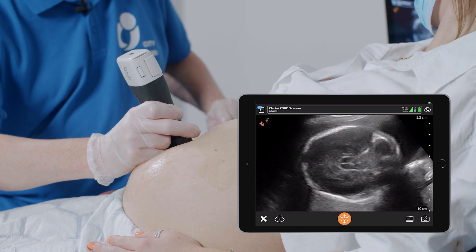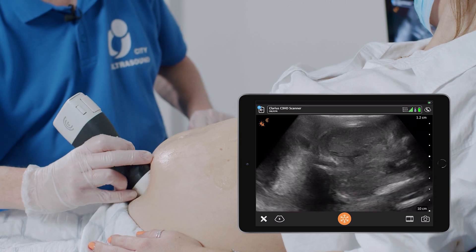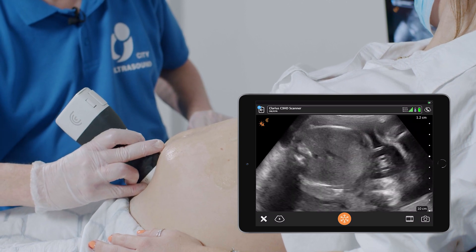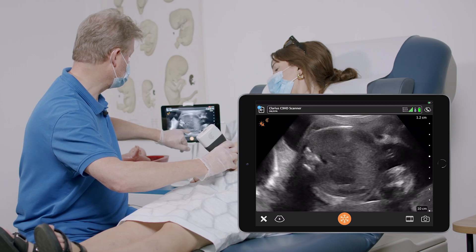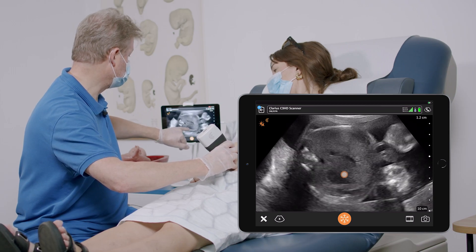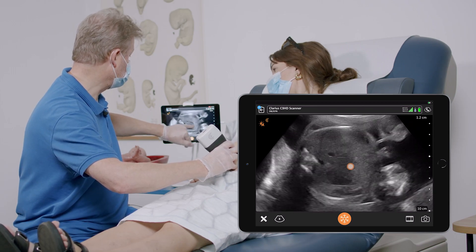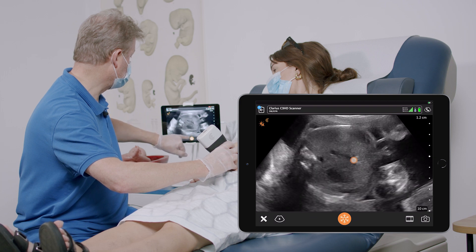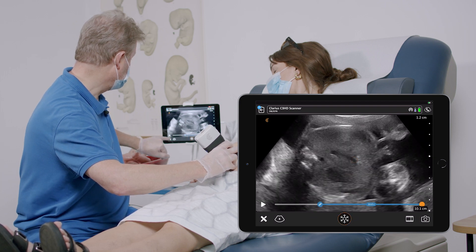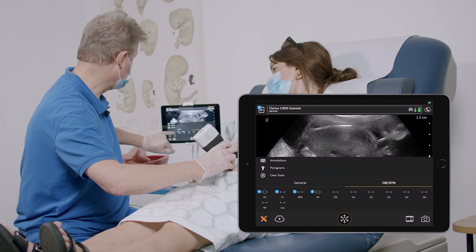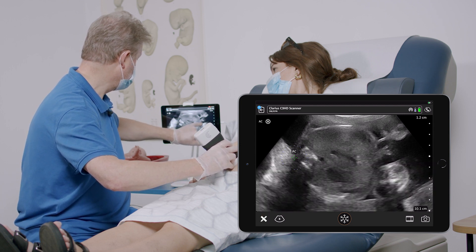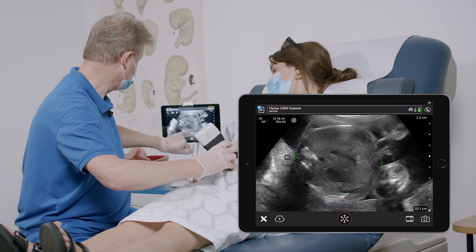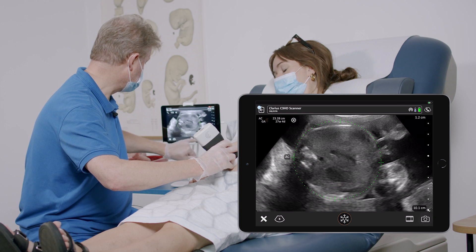Going further, I'm looking down to the cross-section of the abdomen. The most important landmarks in the cross-section of the abdomen will be the stomach and part of the umbilical vein. I'm doing this measurement fast and saving the image.